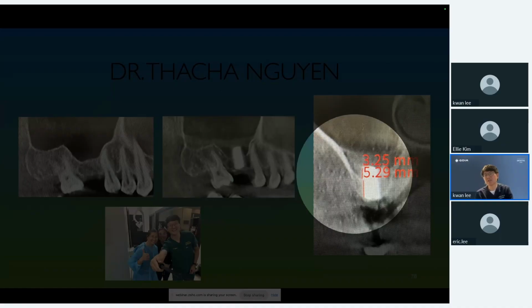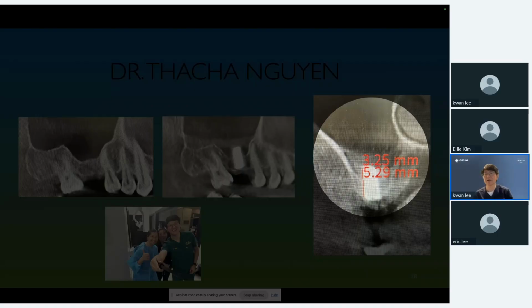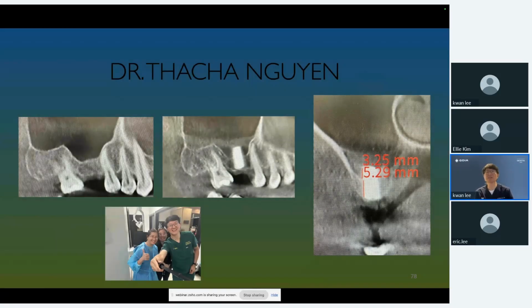The initial residual bone height was 5.29, and the implant apex is about 3 millimeters below the membrane, so I'm guessing she elevated about 6 millimeters with the crestal approach. It's good, because this doctor who said she only wanted to do crestal can now manage much more difficult cases she otherwise would not handle.